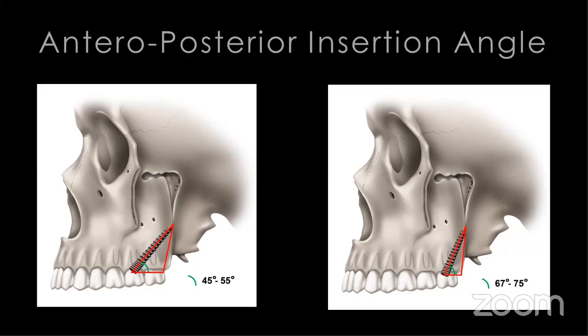One question that many doctors will ask is, do I need to have a cone beam to do this? Do I need a CAT scan? I know in many parts of the world, in many doctors' offices, they do not have a cone beam. While it's ideal and definitely beneficial if you do have one, I would say that it is possible to do this procedure without a cone beam. Because again, once you know the anatomy, once you know all the angulations, once you know the vital structures that you want to avoid, I think that you could still safely place this implant without a cone beam. But definitely, compared with a traditional radiograph, whether digital or non-digital, the cone beam is going to win hands down every time. CAT scan is going to win hands down.